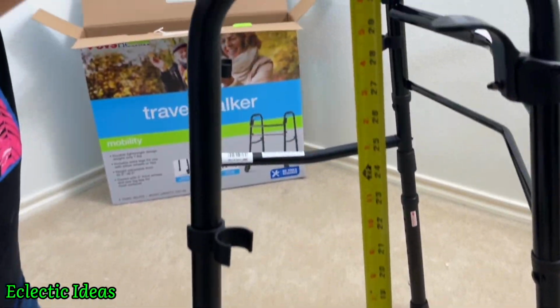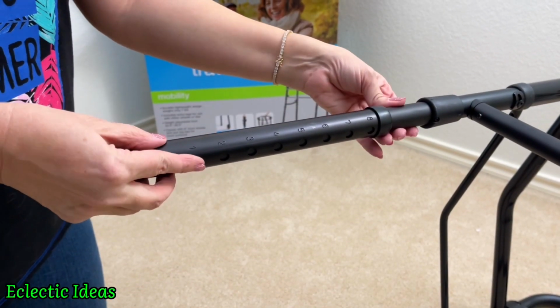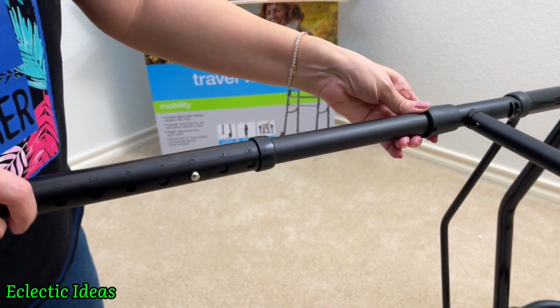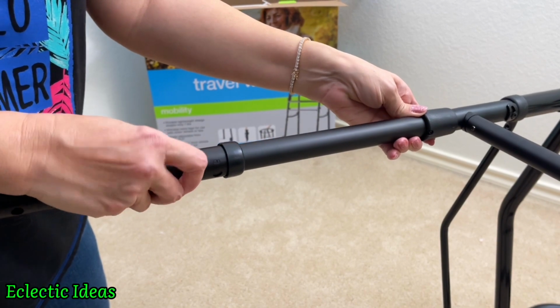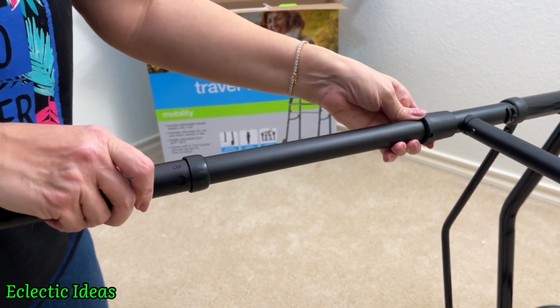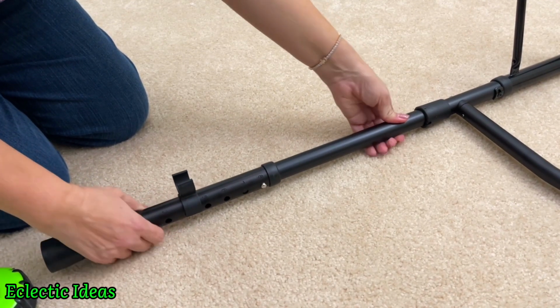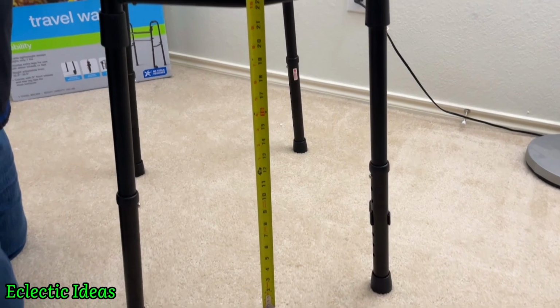At the lowest rung on the bottom legs, the height is 32 inches. Now let's go ahead and depress the legs. You just push this button, and you put it in any notch you like. We're going to put it all the way to the tallest setting. We're going to do that for each one of the 4 legs, because we need to be on even footing here, right? So when we get that done for each leg, we're going to measure it, and we can see that when it's fully extended, it's going to be about 38.5 inches tall.